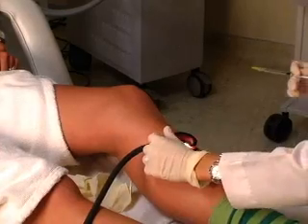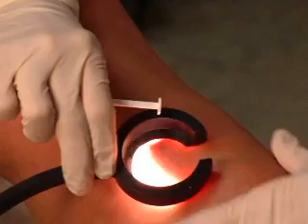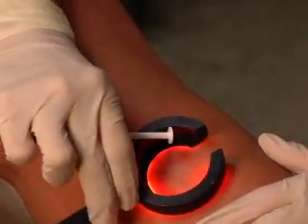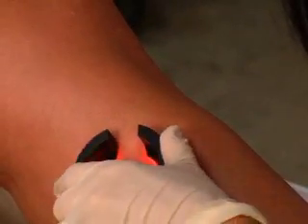So this is a vein light — it's a special light that brings out the vein and shows us the veins that are feeding underneath to this dark colored spot here. I'm going to inject the feeders, as we call them, the dark green veins first.